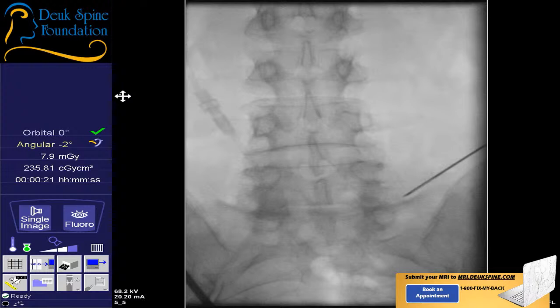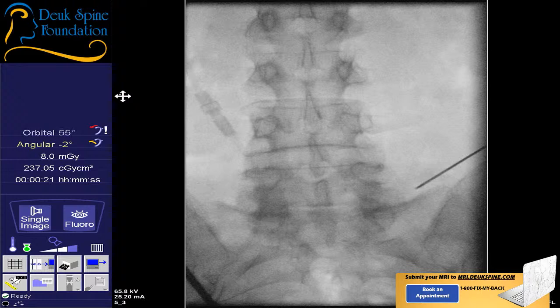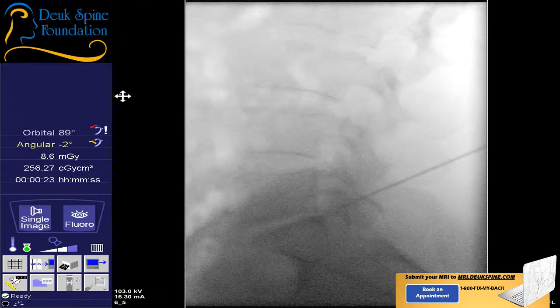I think we need to be a little more medial. Let's go back to a lateral view. Let's go. You do have a bit of arthritis in this facet joint over here that's deflecting us. Are you comfortable? All right, good. That's the joint. Shot. Here we go. Shot.